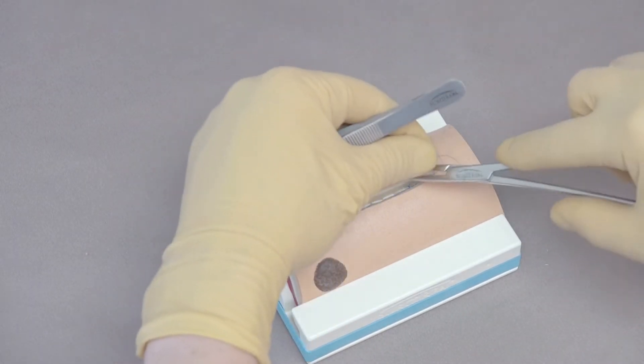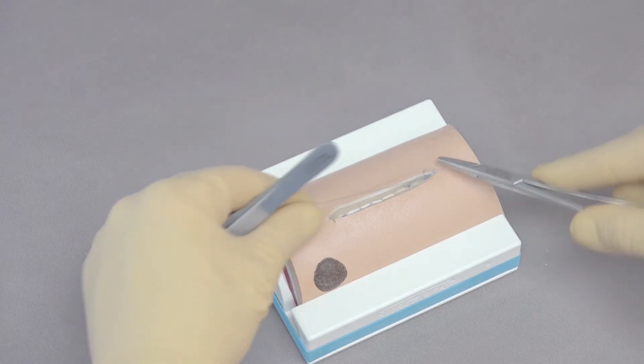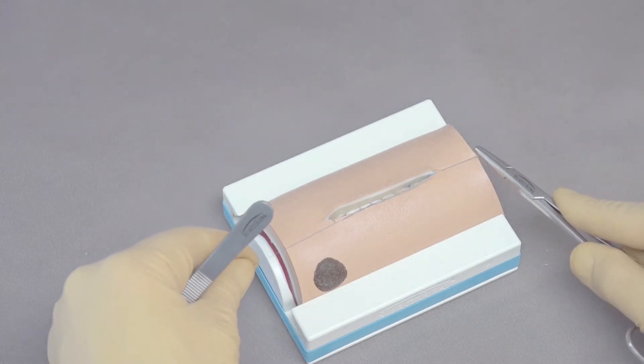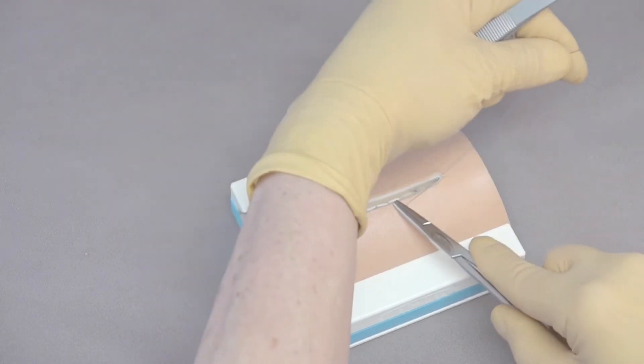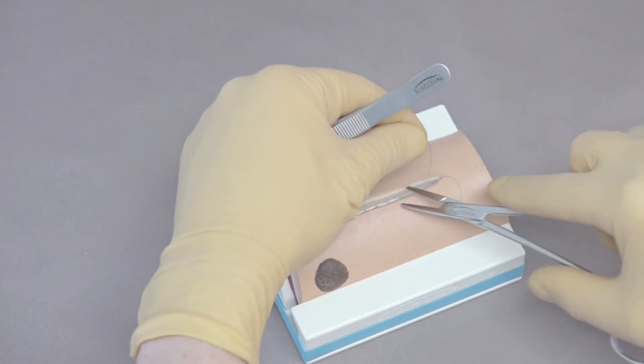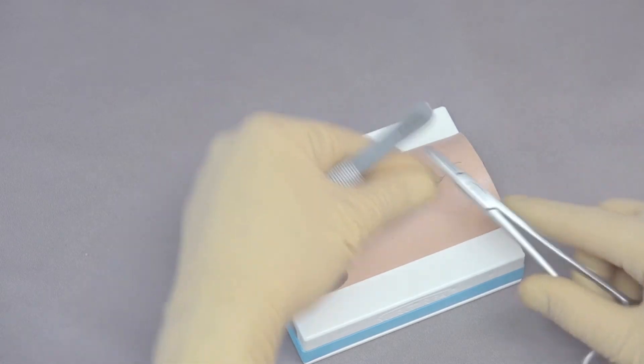I can put this in the middle. Come around and grab the short end. I'm going to tighten again along the incision line. Four throws, four throws square knot.